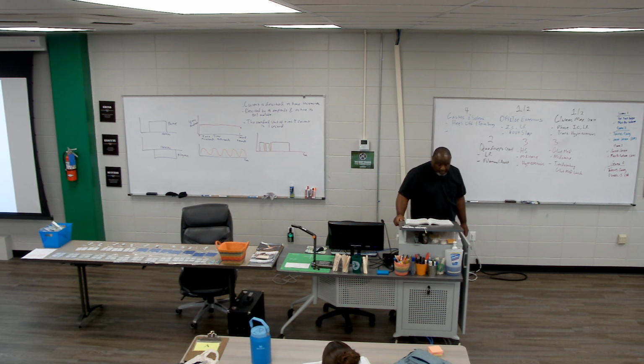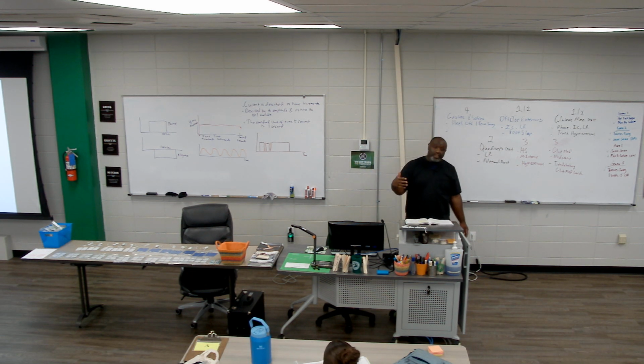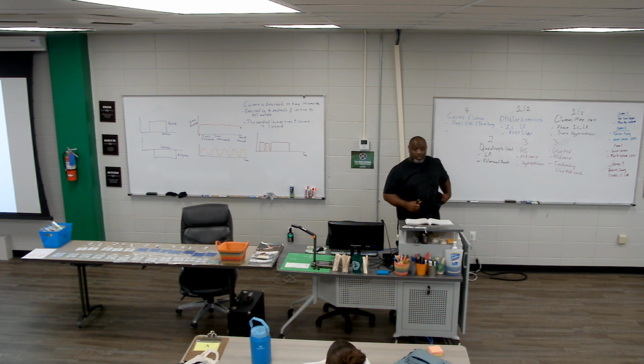It says the burst is perceived by the body as a single pulse. So again, it's all going to feel the same to the patient. We're only choosing these based on our objective for using E-stim with this patient type. What are we trying to accomplish? But your patient is going to feel the same thing, no matter if we use monophasic, biphasic, polyphasic. Patient's going to feel the same thing. It won't be discernible to them.